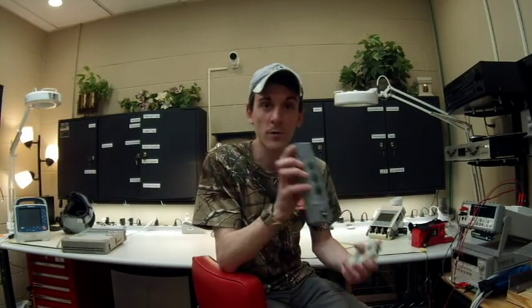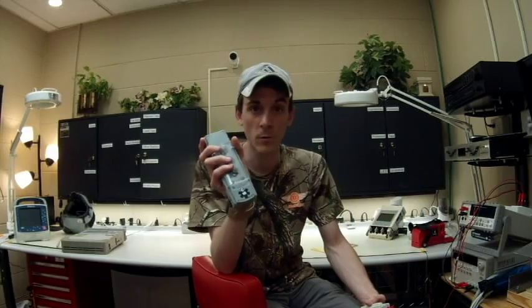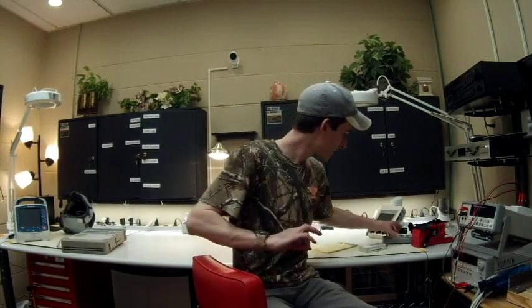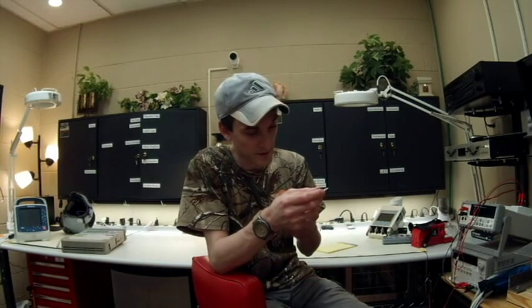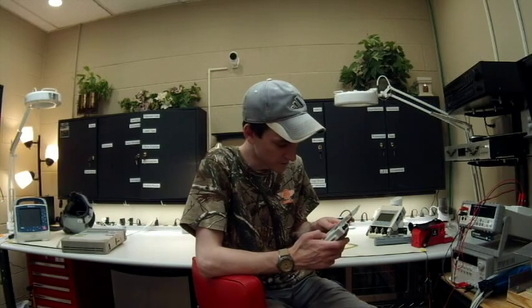Our older pacemaker has a notice — not quite a recall, but a notice — where oxidation on one of the parts will actually cause the BPM rate to increase to the maximum, which I think is 180 BPM. That is more than enough to kill a person. There have been, I think, four deaths due to that rate increase. So there's been a watch issued — you're supposed to pay attention to your patient anyway, but even more so now. The older units are actually a little easier to understand: you have your sensitivity, output, and rate all in one, very simple to use.